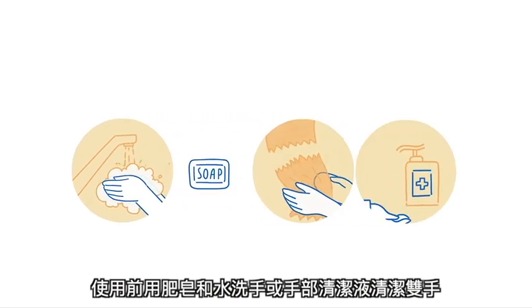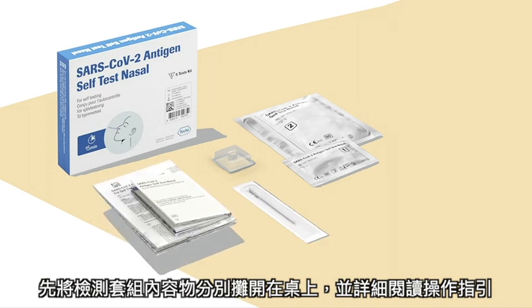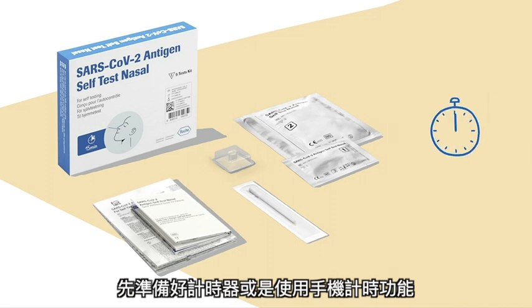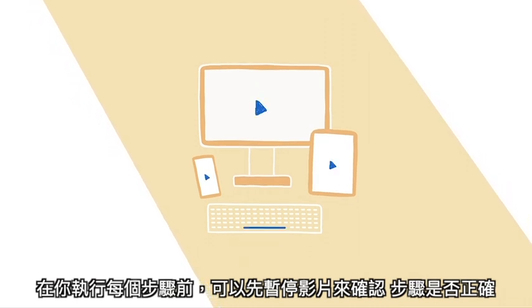First, wash your hands or use hand sanitizer. Place the materials in front of you and read the instructions for use and the quick reference guide with illustrations carefully. Keep a timer at hand or have the timer function on your phone ready. You can pause this video between the different steps. Take the time you need to perform the test correctly.